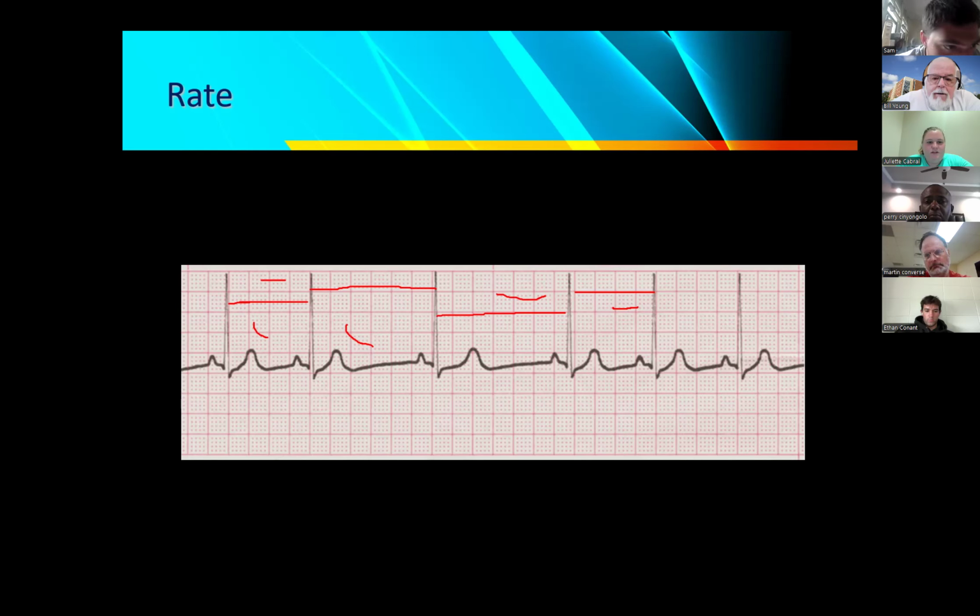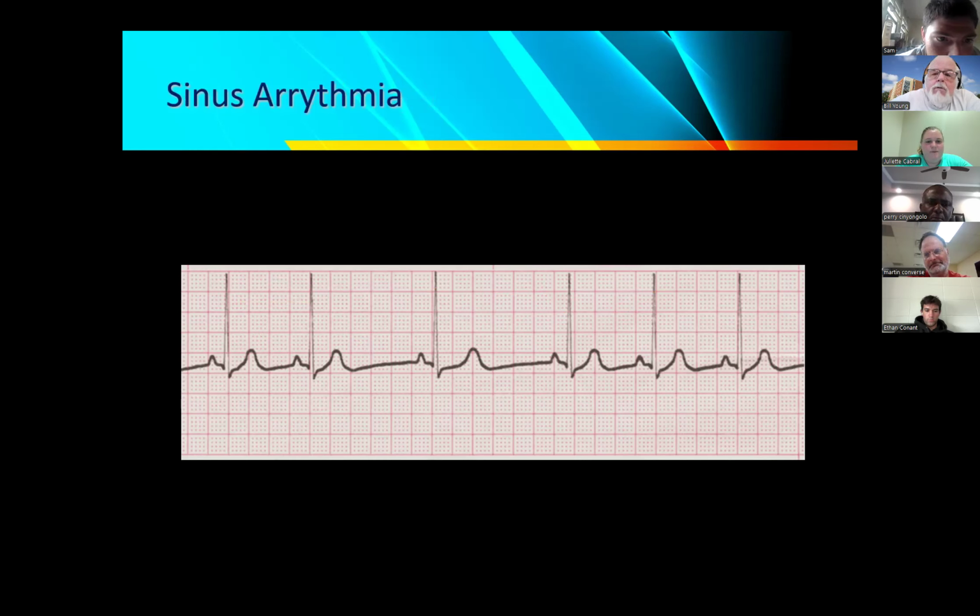Would this be a sinus arrhythmia? Why did it not show up? Oh, you know what? I know why. Because I'm still okay. Look at that. Yes, you are correct. Yes, you're exactly right. It would be sinus arrhythmia.